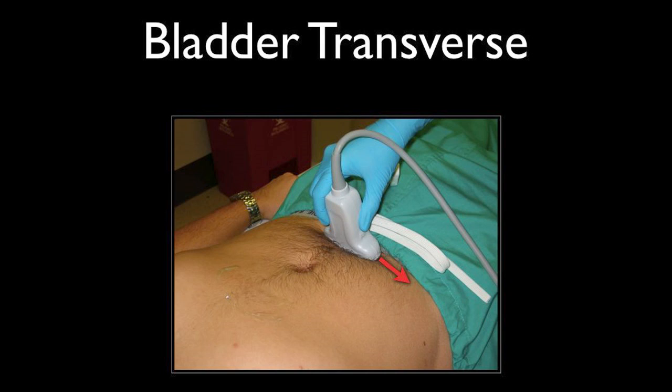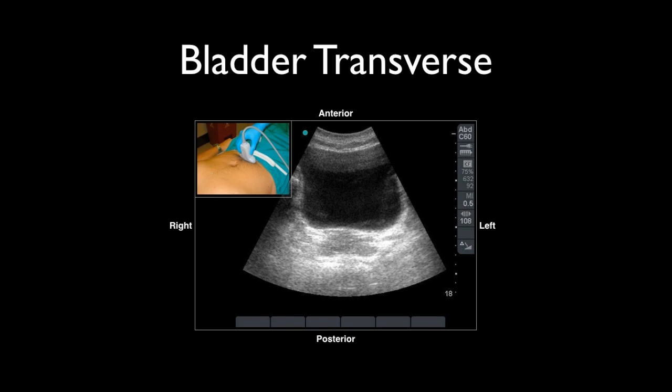For the bladder, you want to put your probe over the suprapubic area and tilt downwards just a bit. You're going to be able to visualize the bladder with your indicator towards the left — that's going to be the right side of the patient. You'll see that cube or square structure, and in this case the area underneath the bladder is the prostate gland.